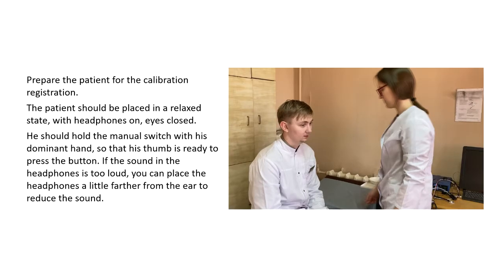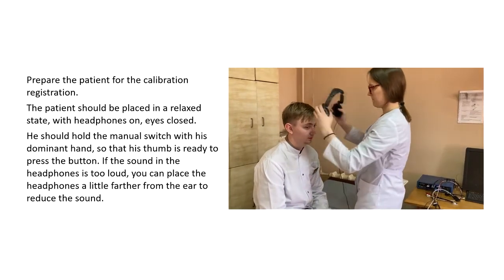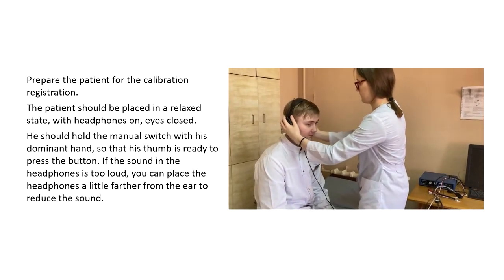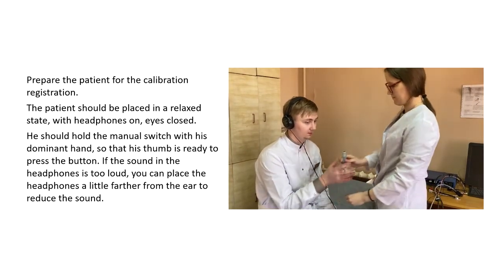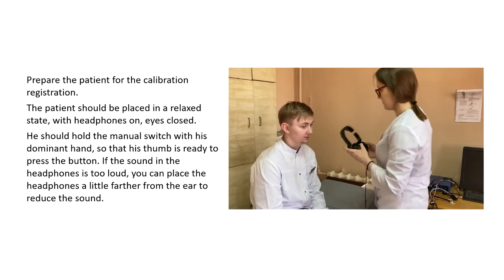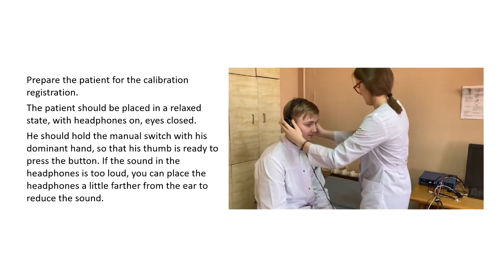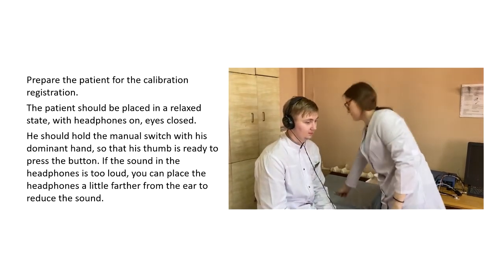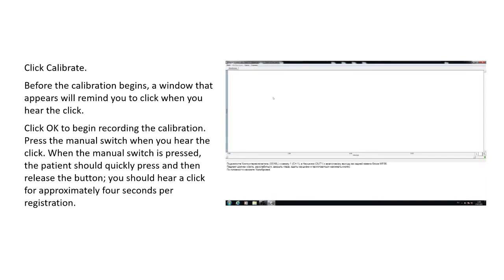Calibration. Prepare the patient for the calibration recording. The patient should be placed in a relaxed state with headphones on, eyes closed. He should hold the manual switch with his dominant hand, so that his thumb is ready to press the button. If the sound in the headphones is too loud, you can place the headphones a little farther from the ear to reduce the sound. Click Calibrate.